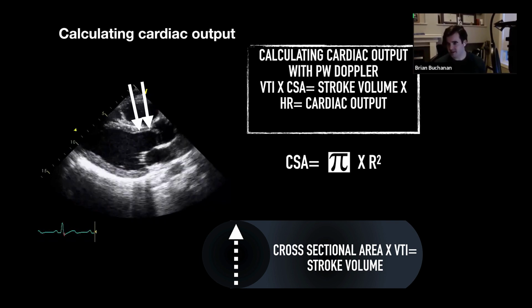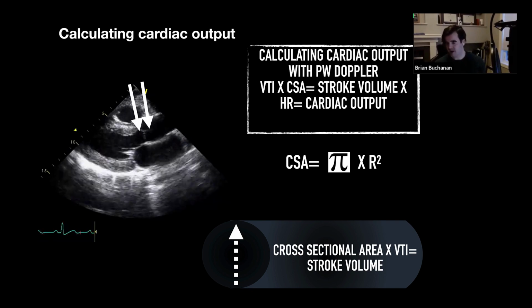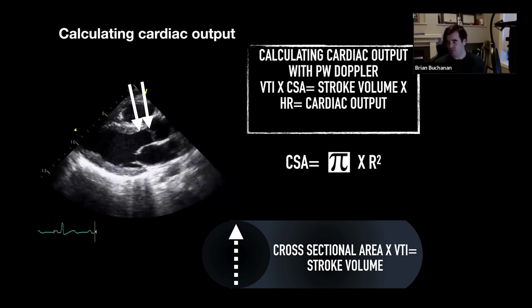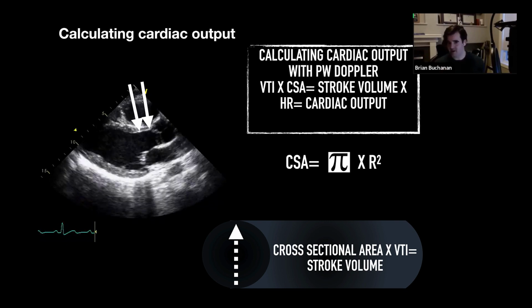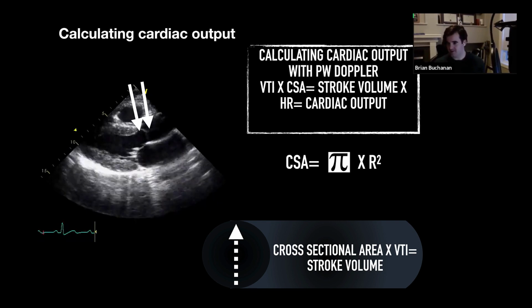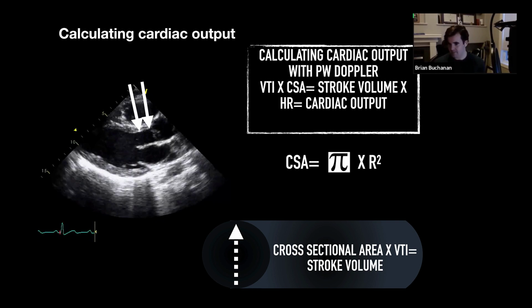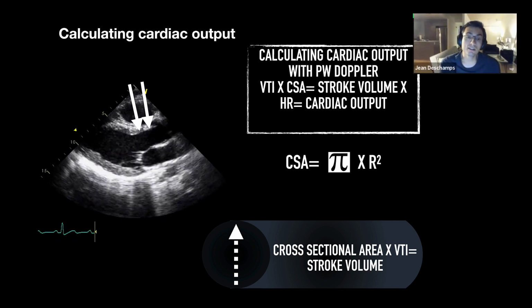And if it's placed at the aortic valve annulus, then you should be measuring the aortic valve, obviously in systole. But you really want a high quality parasternal long axis view. And I think there's a lot of emphasis on making sure you can see that endocardial border really well, right? Yeah, and you also want to see the leaflet insertion really well.